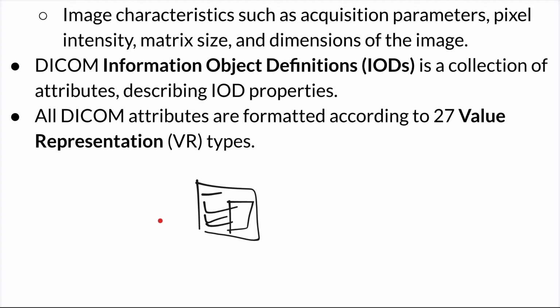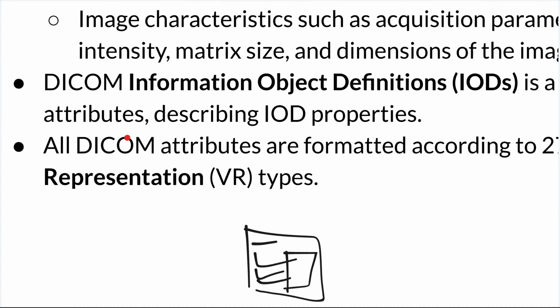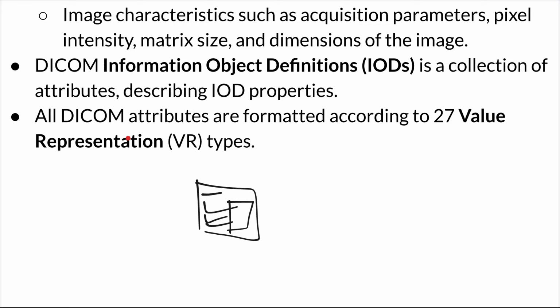All right. So we said DICOM models things like objects. Because of that, when you put the properties and all these things together, it becomes the IOD, information object definition. So the objects, the properties, the attributes, trying to put everything together, that is how we get the IODs.